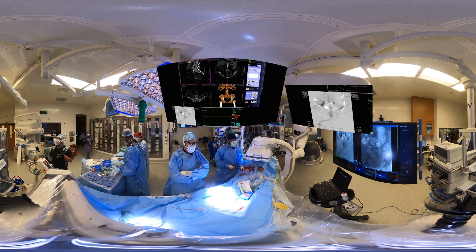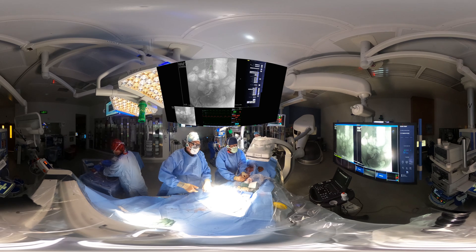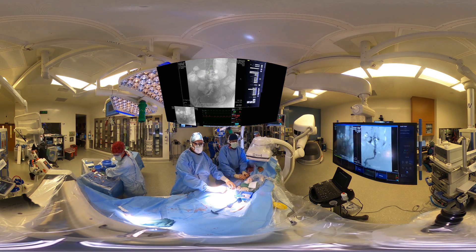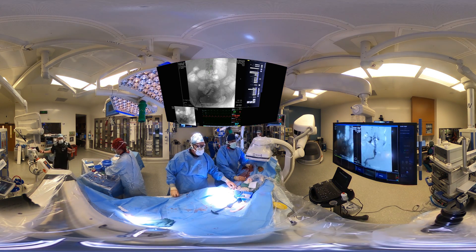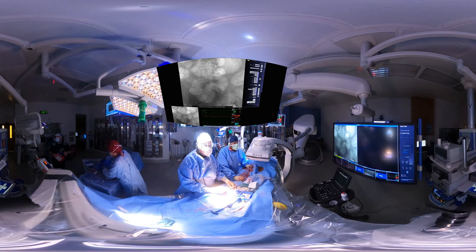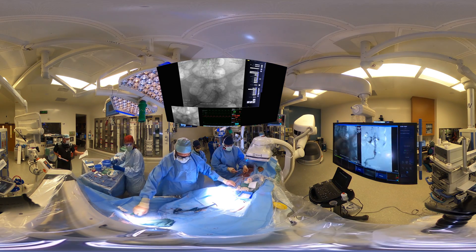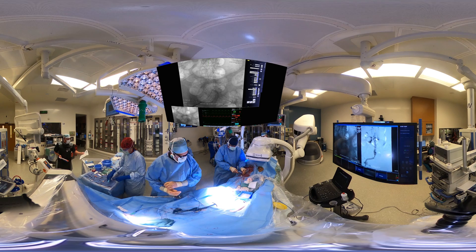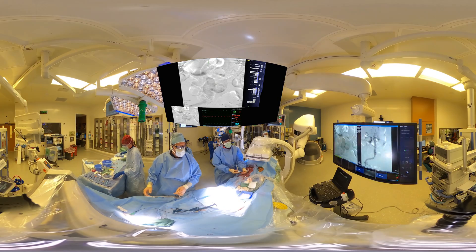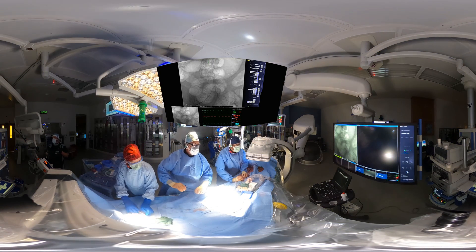After we gained access, there was a question from the CAT scan about a right iliac artery stenosis. We opted to go ahead and angioplasty this and actually put a 10mm VBX stent into this. So right groin access, angioplasty, and stent grafting. We'll listen in as we do the completion angiogram — nice resolution of the stenosis. We're going to opt to flare out the 10mm VBX as it emerges up into the bottom end of the aneurysm.